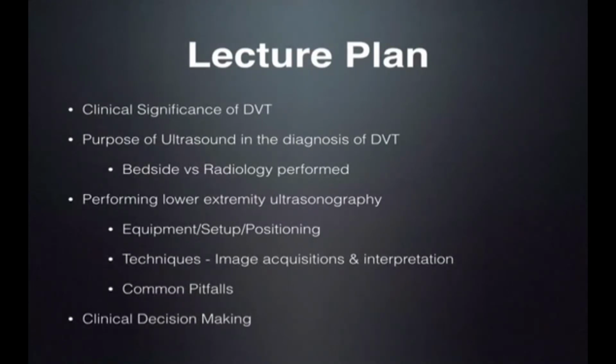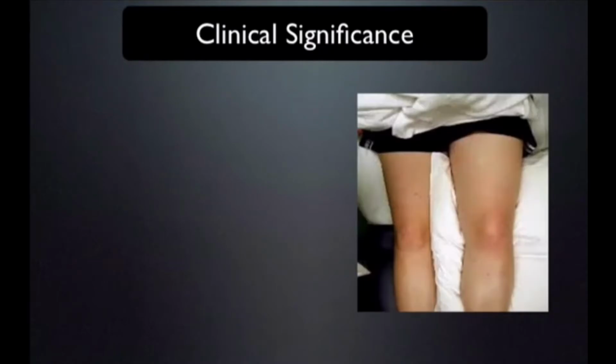We'll then get into performing the actual exam, image acquisition and interpretation, talking about the equipment, the setup, the patient positioning, and common pitfalls when performing the ultrasound. And we'll wrap up by talking about the clinical decision making and how DVT ultrasound can change our practice and be utilized in our practice. So let's get started and talk about the clinical significance.